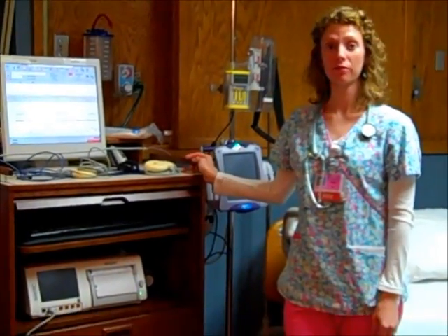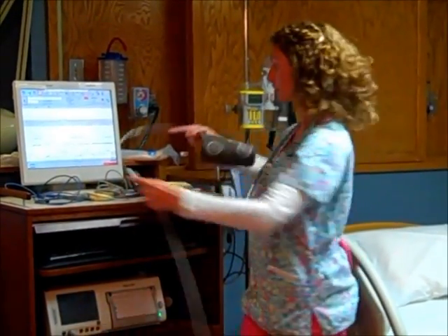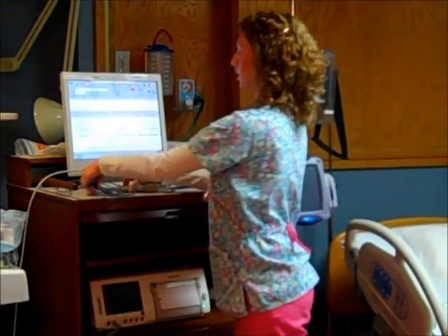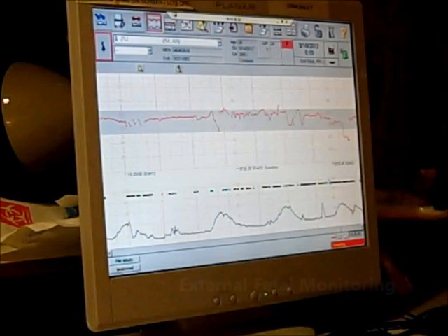When a patient is admitted for labor, you're going to start just like you would with any normal patient. You're going to do an assessment. That would start with vital signs. You've got a blood pressure cuff, which you can change for size. It's an important tool. You can measure pulse oximetry. You guys all know about that. Thermometer.